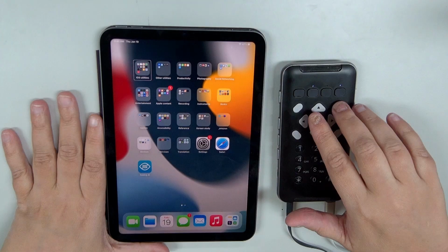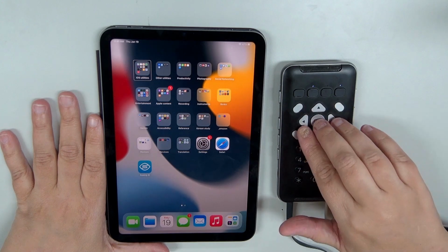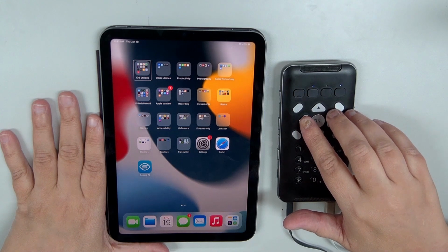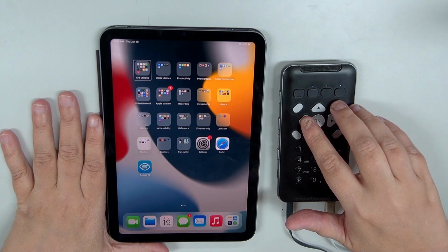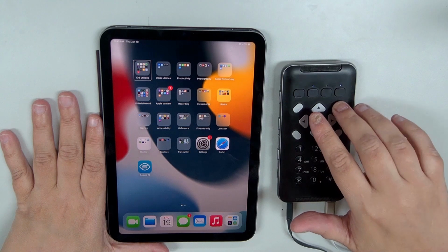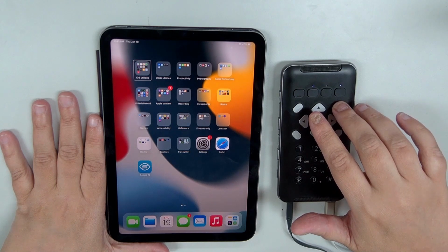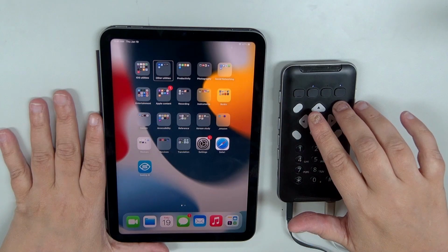You may also be wondering, as you consider this, just how we perform all the various functions of these mobile devices using the limited SensePlayer keyboard. We handle that by utilizing various modes for each key map, and you can change these modes using the menu key. Web browsing mode. Text input mode. Navigation mode. And I'm just pressing the menu key repeatedly to cycle through the various modes. When you activate or reactivate a connection, it always uses navigation mode by default.